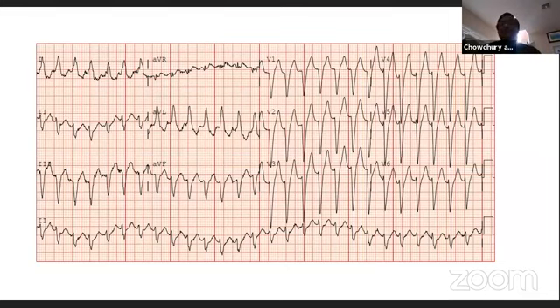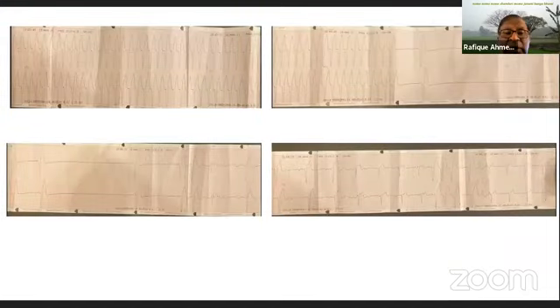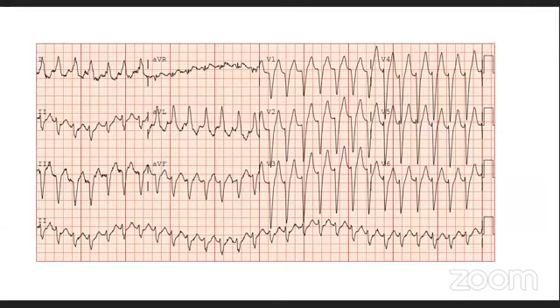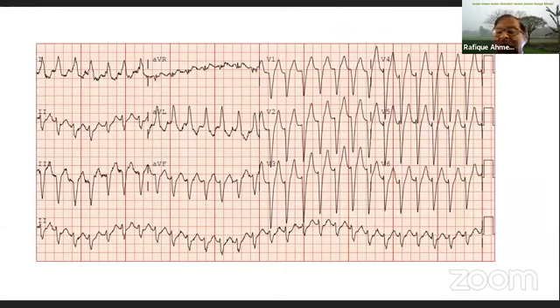Adenosine broke the tachycardia. Athar bhai said adenosine dependent, the circuit was broken. Very well said, Athar bhai. I want to know why this patient has wide QRS tachycardia. Can you go back to that EKG, please? First, we see wide QRS tachycardia at a rate a little bit over 150. And if it is VT, my patient's life can be at risk. And I am choosing adenosine based on what my young doctors need to know. Sometimes adenosine converts ventricular tachycardia also. Why do you think this is not VT?